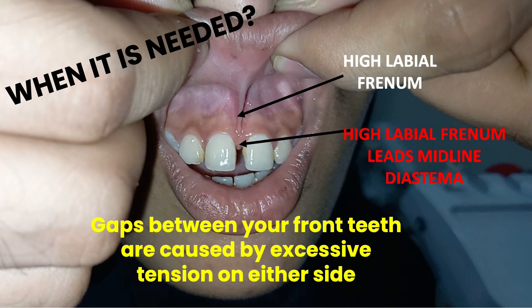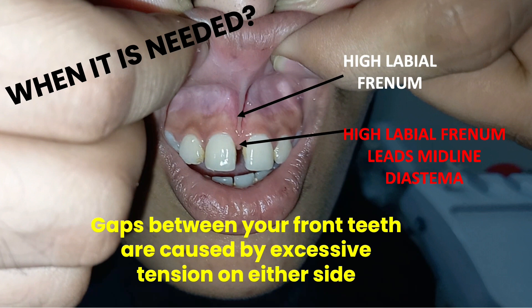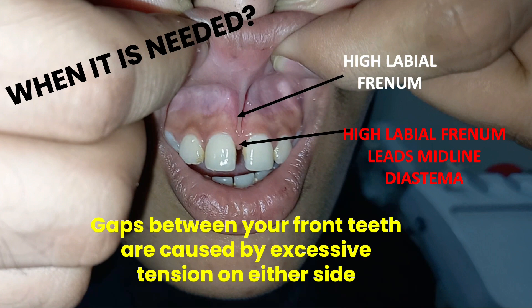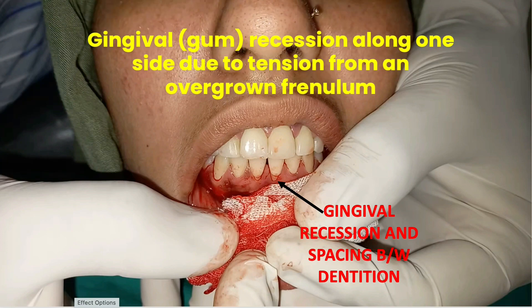We have to remove the frenum before orthodontic treatment, because if we perform ortho treatment to close this gap while the frenum is still high, there is a high chance of relapse. We remove the frenum before ortho treatment to close the midline diastema and decrease the chances of relapse.